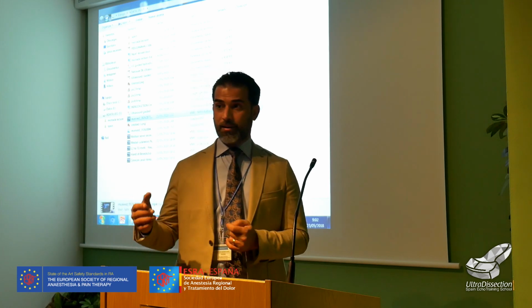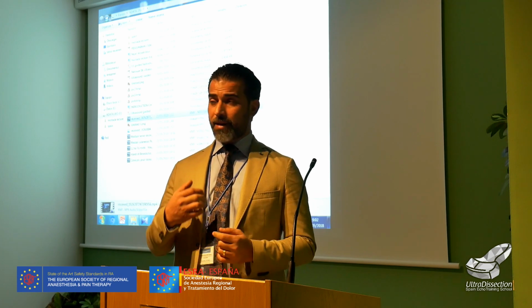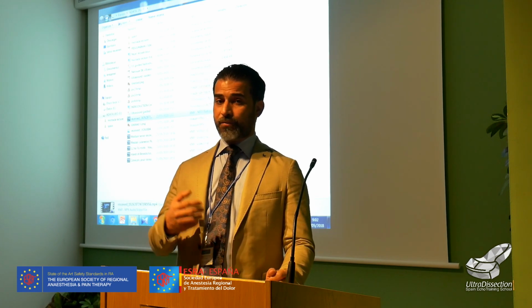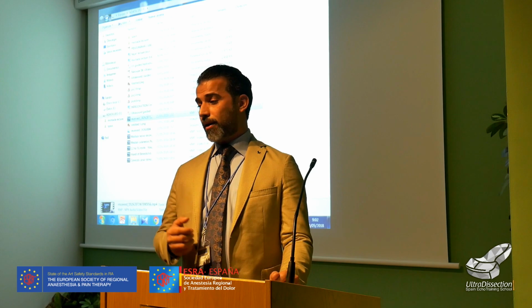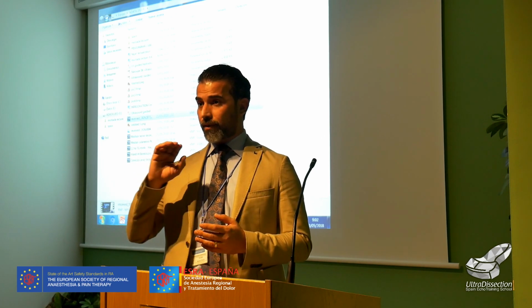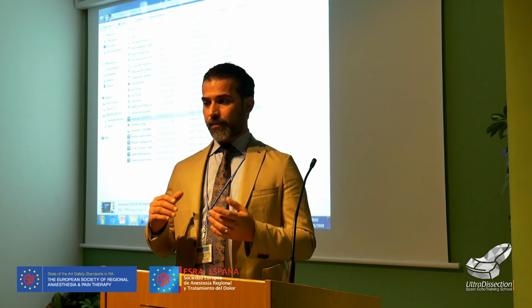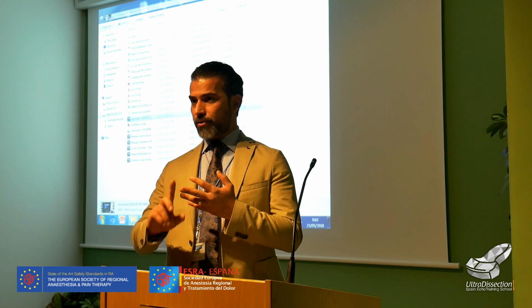Sometimes, as Professor Bayer said, about the lumbar also. In my practice, I teach my resident or fellow how to do transforaminal injection by ultrasound, not for the final procedure, because I want to save the time and radiation exposure.